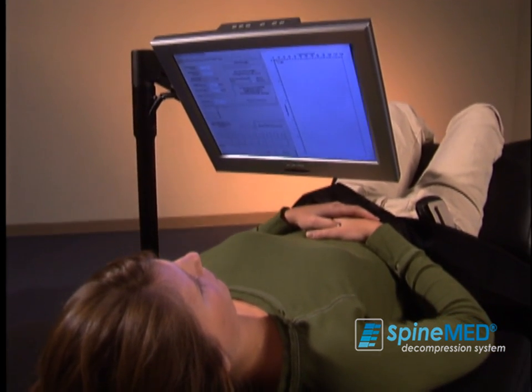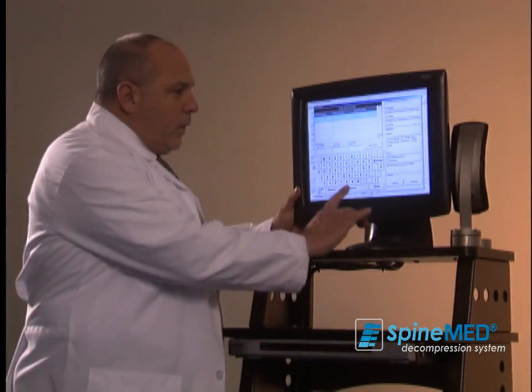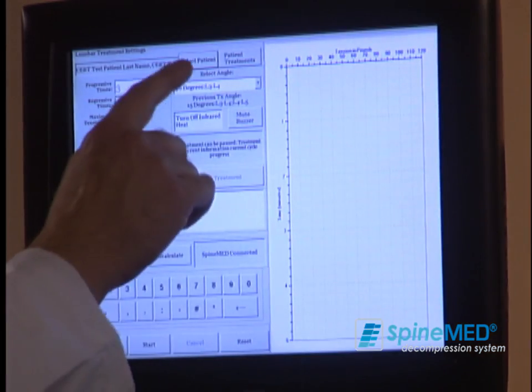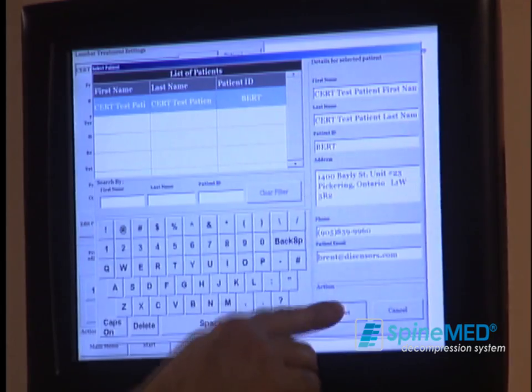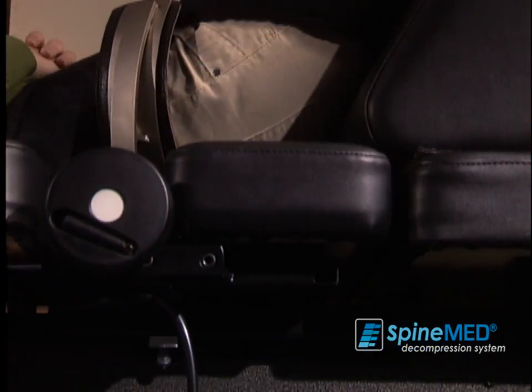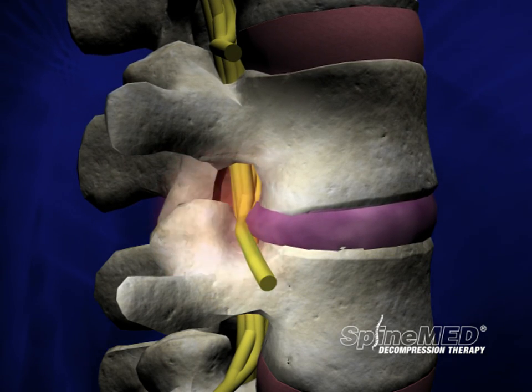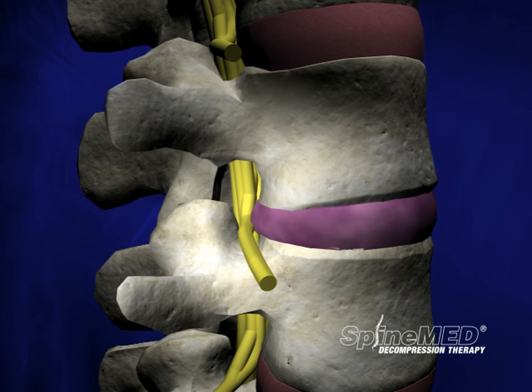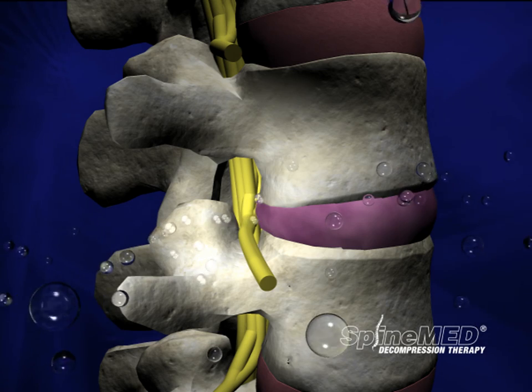This procedure takes place with the patient fully clothed and has been described as safe, painless, and extremely effective. Through precise computer controls, the SpineMed is designed to target the damaged lumbar or cervical discs and then gently distract the spine. Under distraction, the pressure exerted on the disc is reduced dramatically, which may help draw the bulging or herniated gel-like material of the nucleus back into the center of the disc, relieving pressure on the nerves.